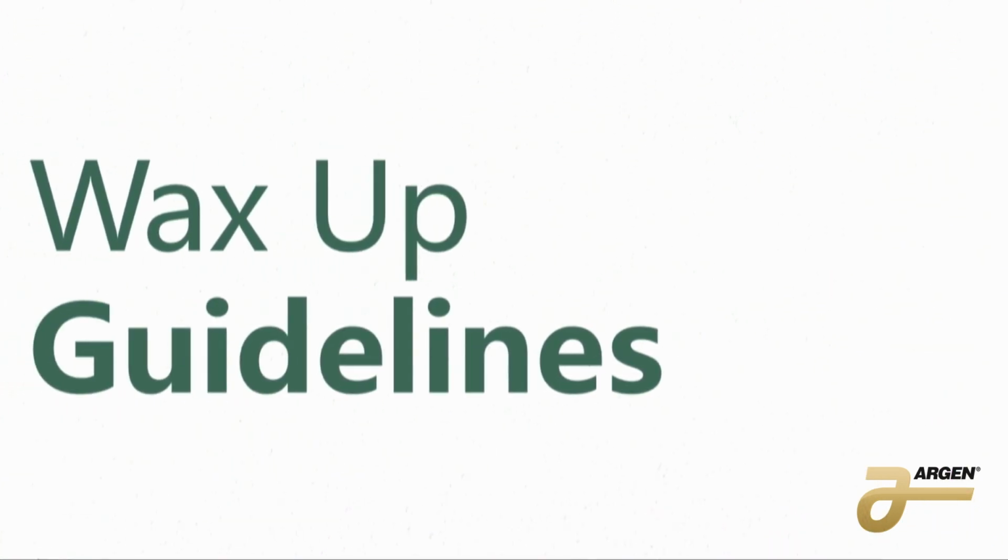So we'll go through some wax up guidelines, and then I'm going to plug in my computer and we'll go through some 3Shape design and kind of how we can check these functional limits. And again, very rudimentary stuff today. Please come talk to me if you want to go more in depth.